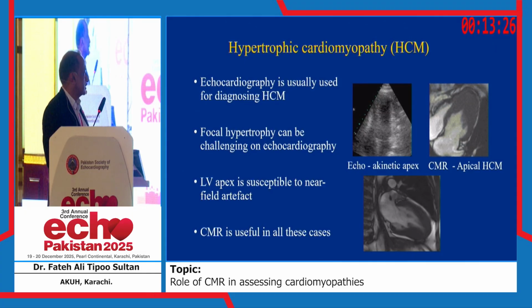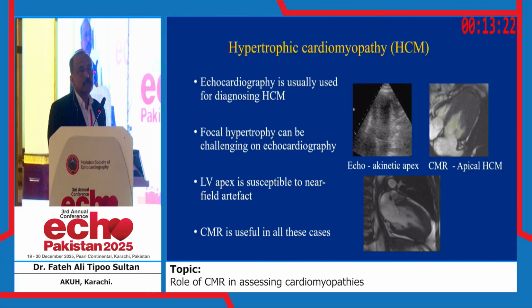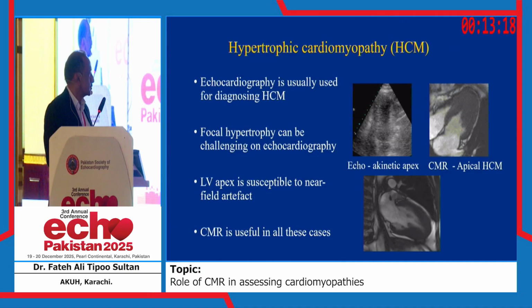As I told you, in cases of LV apex involvement, even the echo may miss the diagnosis or may give you the wrong diagnosis. So CMR is useful in these patients.